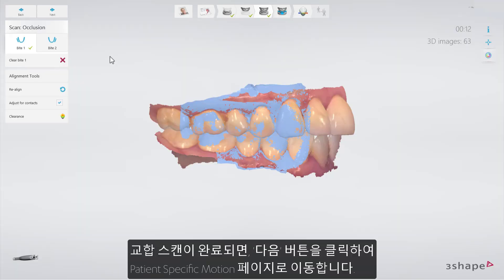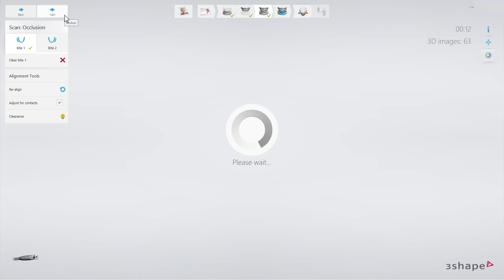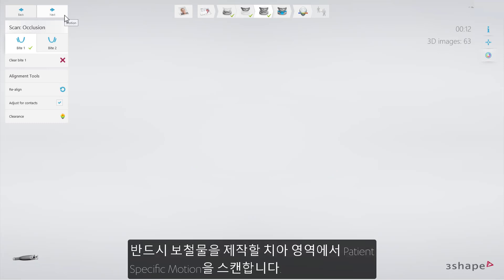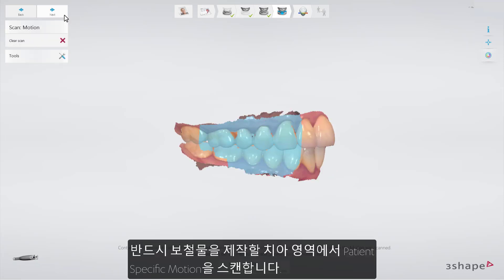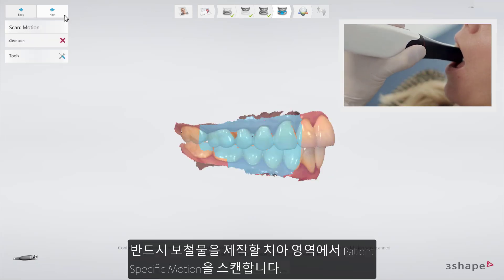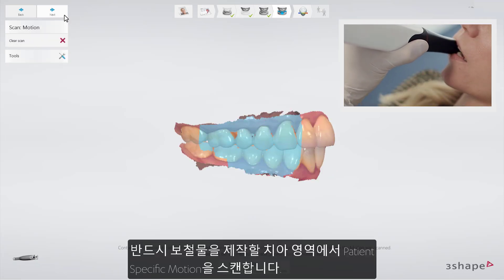After completing the bite scan, click Next to go to the patient-specific motion page. Make sure you create the patient-specific motion scan only in the side where you want to make the restoration.